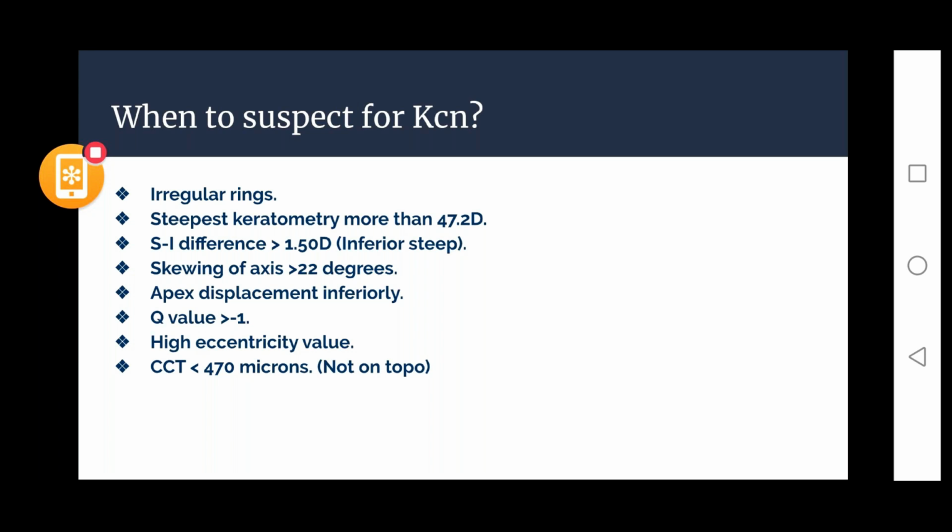So you have to remember that most of the signs may be absent and still the patient may be having keratoconus, because the keratoconus starts from the posterior surface of the cornea, right? So in such cases you have to put the patient on Pentacam or any kind of corneal tomographer. Now can someone please tell me what could be an early sign of keratoconus?